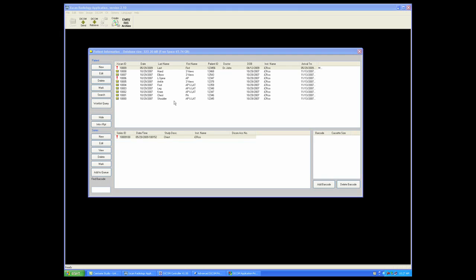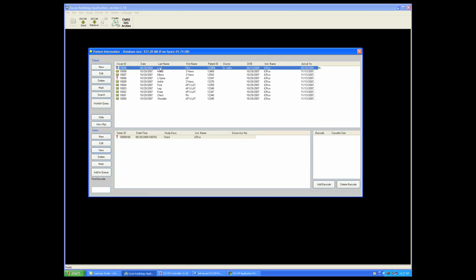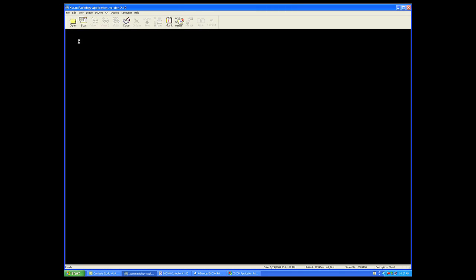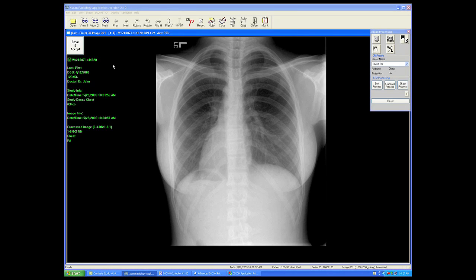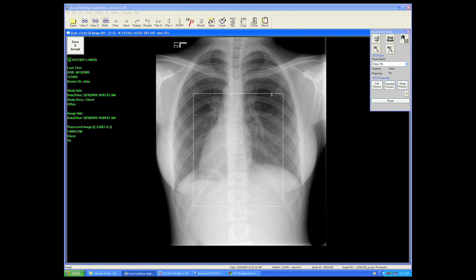Now I'd like to talk a moment about image optimization. Whenever a new image is acquired, your image will always launch for the first time with a dotted or dashed line box in the image. This is called the smart box. The smart box assigns a window and level to the image based upon everything that is seen by the software or by the computer inside the smart box.